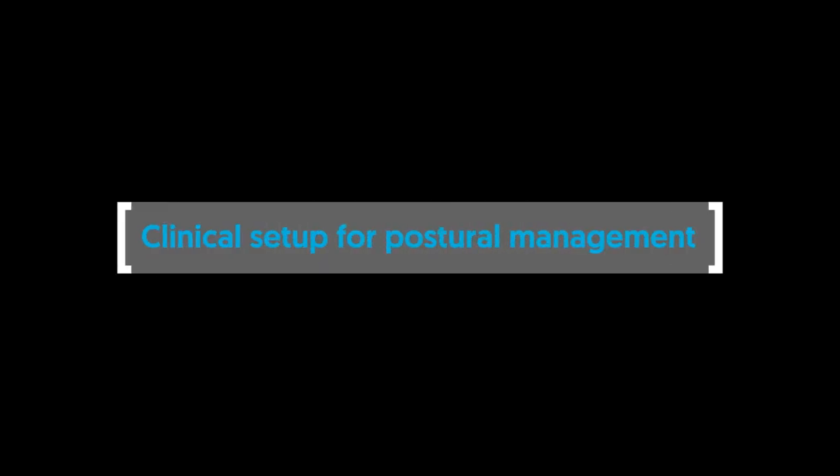Clinical setup for postural management. The clinical setup of the Beamey seat should be completed by a technically and clinically competent person who has been trained in the use of the product. Set the backrest height, seat depth and footplate height before placing the child in the seat. These can be fine-tuned when the child is in the seat.